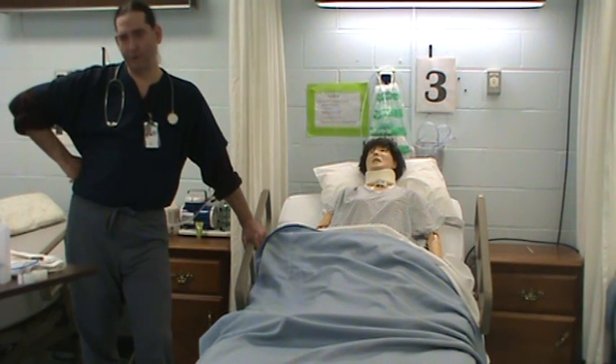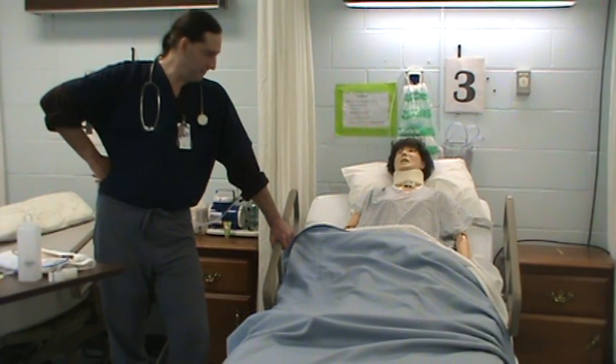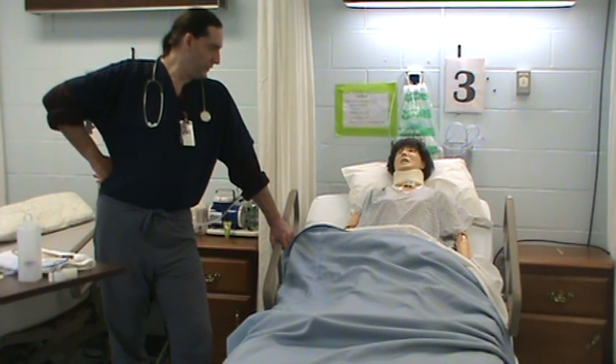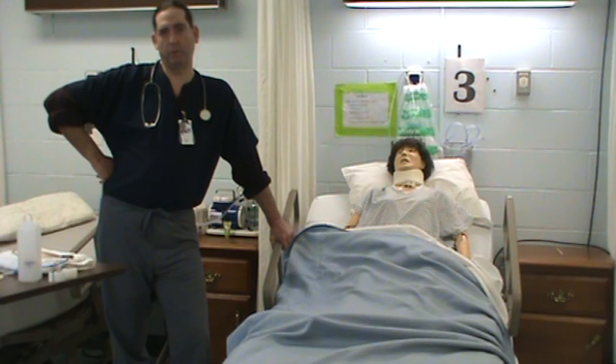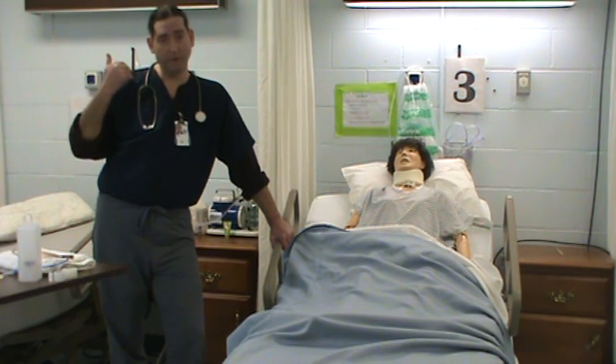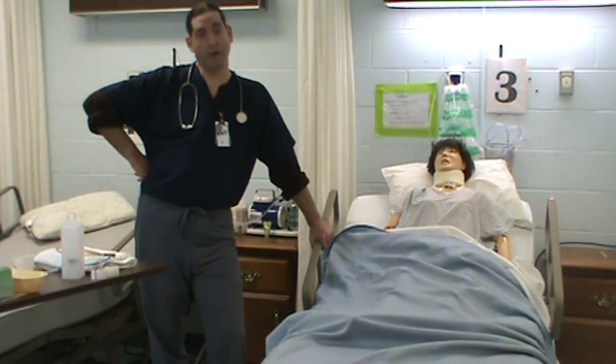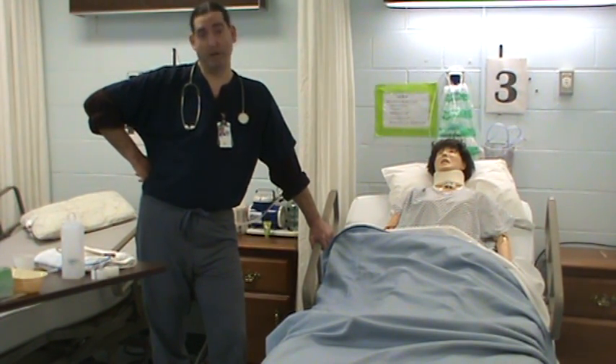Jim Adams here again. We're going to do an NG tube placement. NG tubes are uncomfortable. I've heard people talk about folks vomiting when you put it down. I've been putting them down for 20 years and I've never actually had a person vomit, but I've heard that they do.